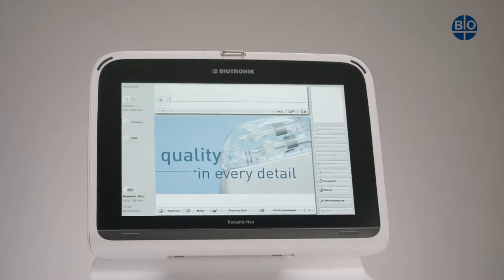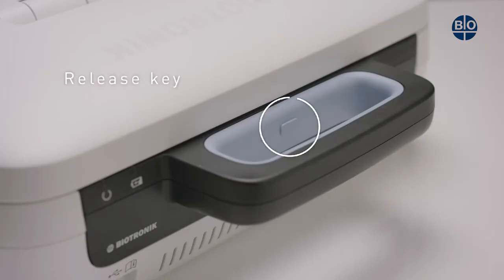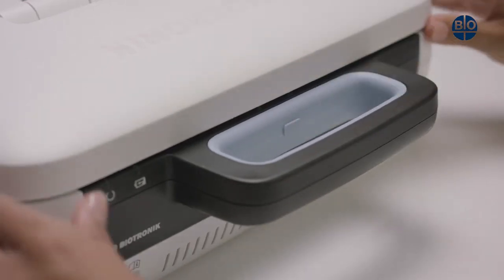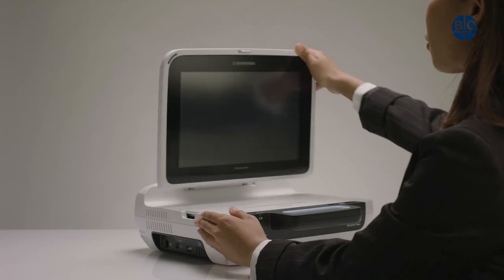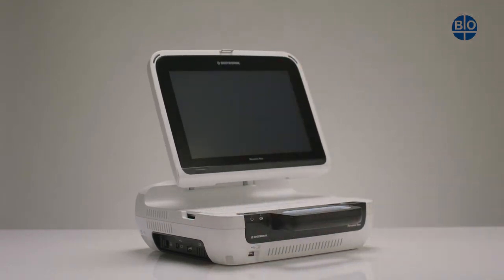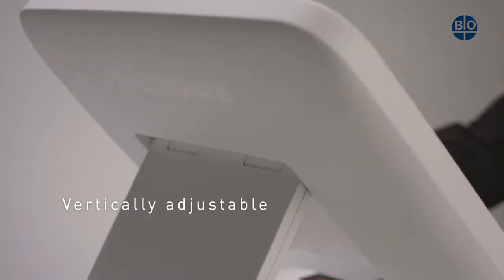To begin, open the screen. Look for the release key, which is located on the inner side of the handle. Then, using both hands, adjust the display to the desired position. The display is vertically adjustable.